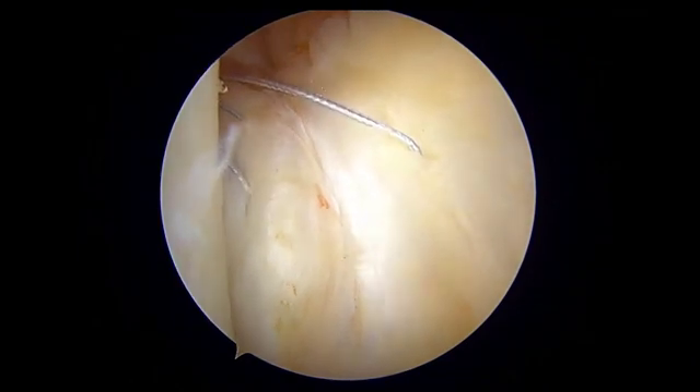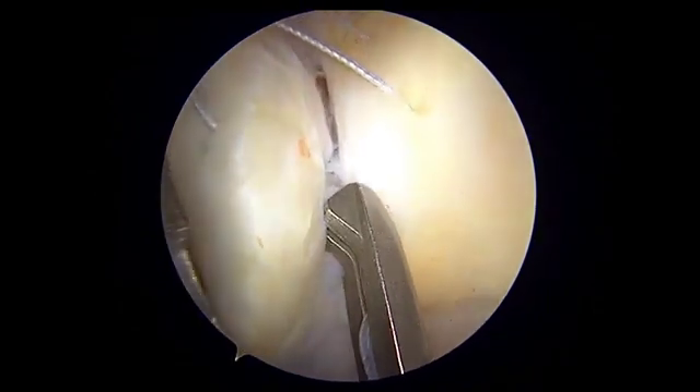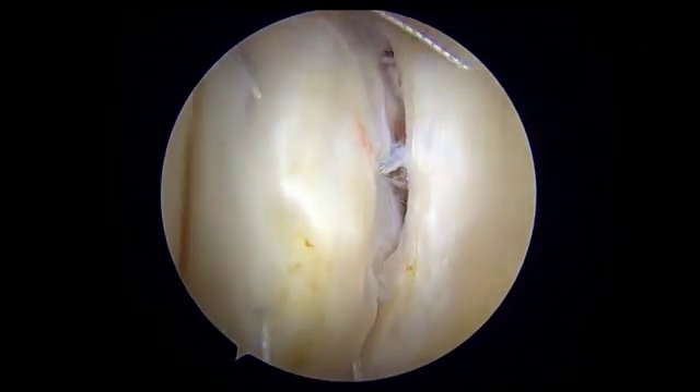Again the step is repeated as this tear is huge. A bite is taken from the meniscus using the knee scorpion loaded with FiberWire, and then the second bite is taken through the posterior capsule.